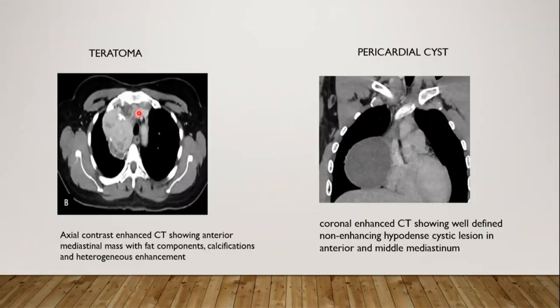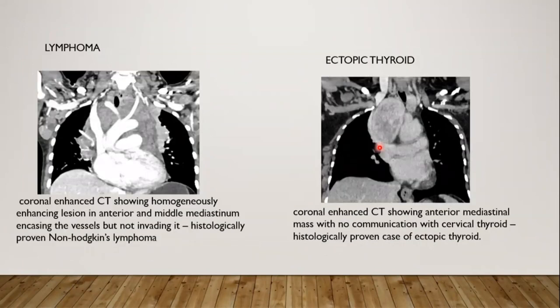Teratomas on post-contrast study show heterogeneous enhancement with areas of fluid-filled cysts, fat, soft tissue component, and calcifications. Pericardial cysts on contrast-enhanced CT appear as a well-defined non-enhancing fluid attenuation lesion next to the pericardium. Lymphomas show a homogeneously enhancing lesion in the anterior and middle mediastinum encasing the vessels but not invading them. Ectopic thyroid in the mediastinum is very rare; here we can see a well-defined heterogeneously enhancing lesion in the anterior mediastinum, which was a histologically proven case of ectopic thyroid.